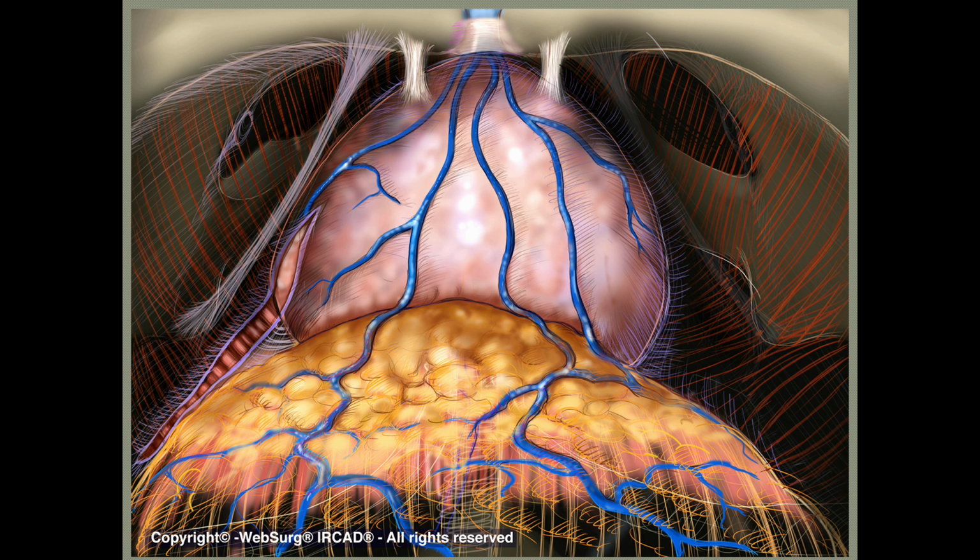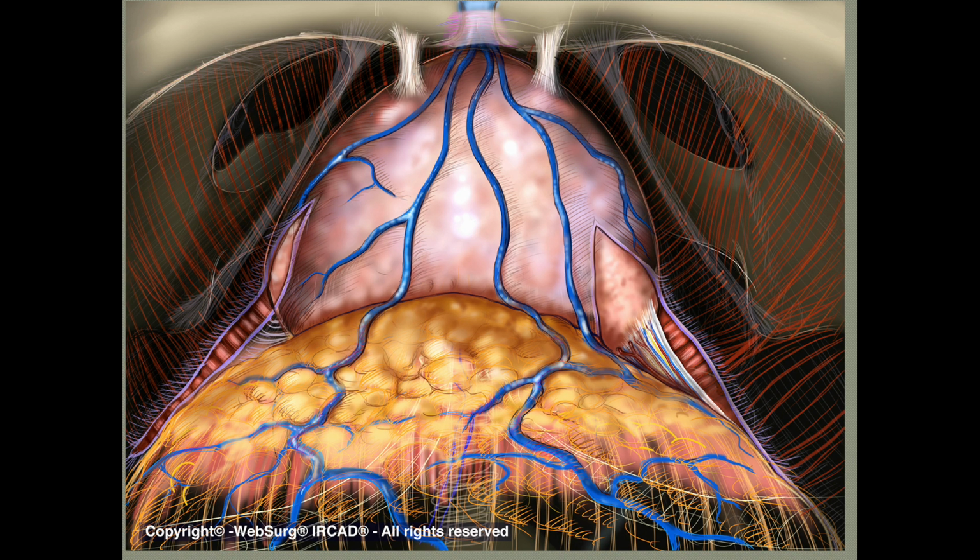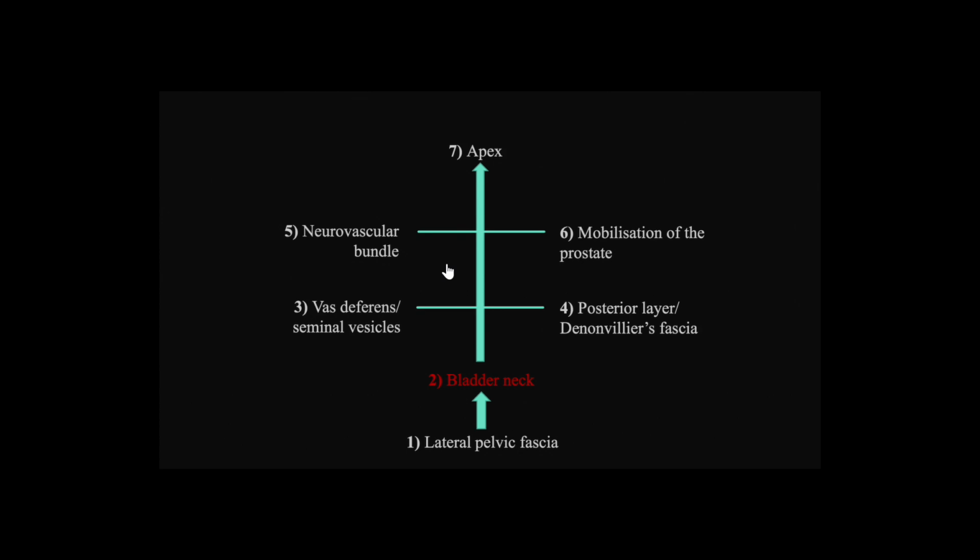For the opening of the endopelvic fascia, it's not always done. But I think when you are young, you have to do it, because you will see much better the bulk of the prostate. And with experience, you will stop, and then you can just incise in front of the puboprostatic ligament and try to spare everything. But I think at the very beginning, open the endopelvic fascia, you will see better, and then slowly you improve your skill.